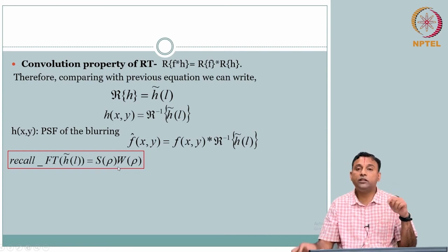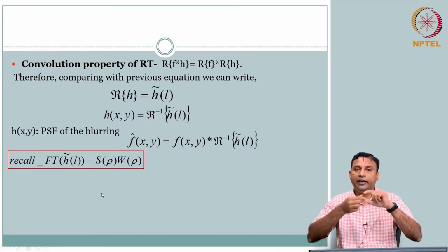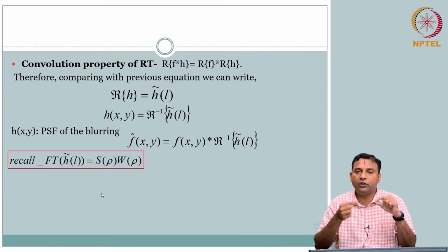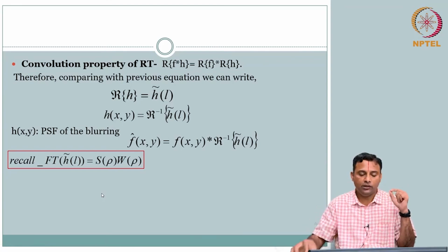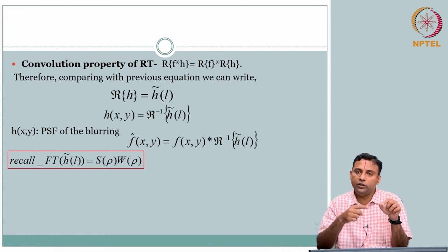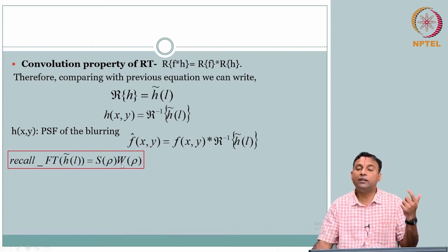What is this? This is for applying the filter for every line of your projection, right. For every theta, your G of L comma theta is a collection. So, each of the 1D detector data, the detector has an effect and you are doing filtering. That is how you did it. You did this for every theta, same thing, and therefore this is circularly symmetric. It turns out that the Fourier transform of this is circularly symmetric.